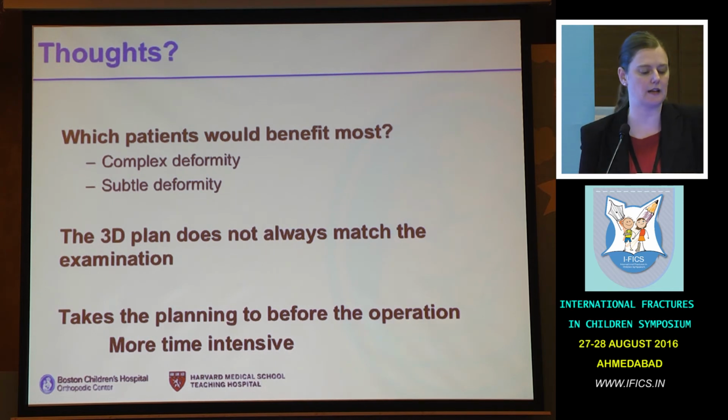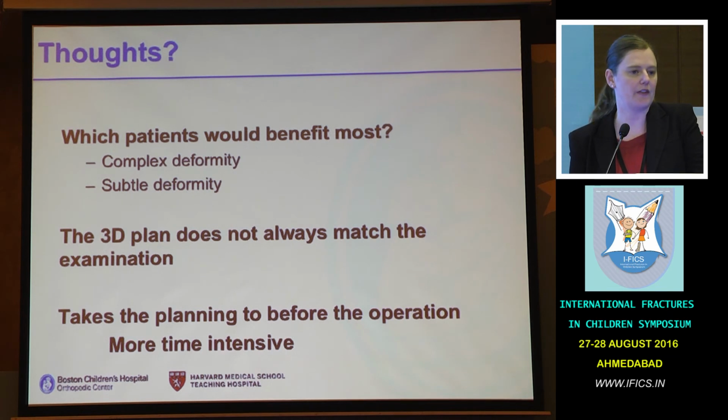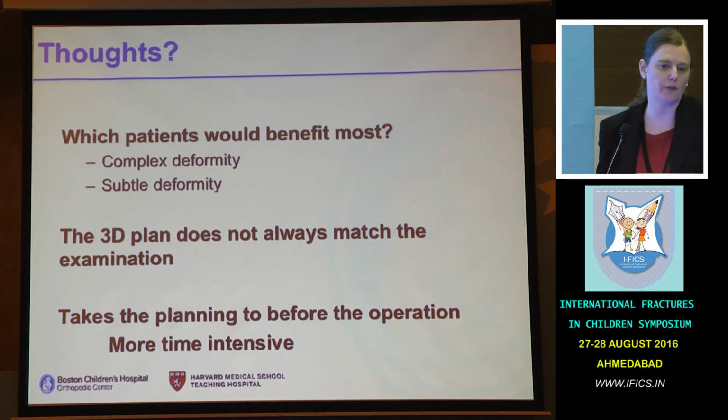I think that it may be more useful for the subtle deformities more so than the complex deformities. I think with the complex deformities, we have a different set of priorities in what we're trying to achieve for the patient. The 3D plan is not the answer. I actually spend more time thinking about these patients. I think the 3D plan takes some of my planning out of the operating room to doing it before, but I think I now spend longer planning the surgery. And overall, I think that this has been a good addition to my practice.